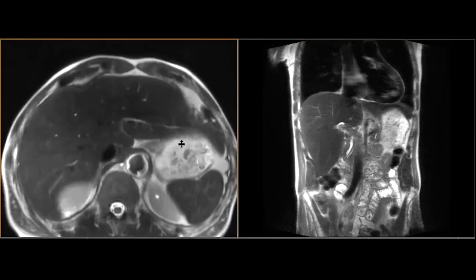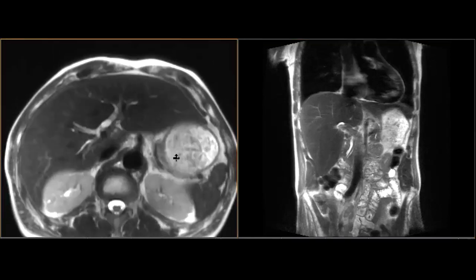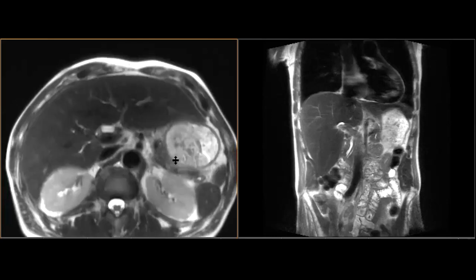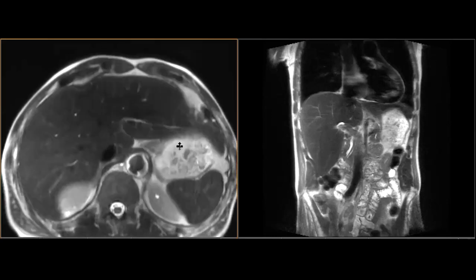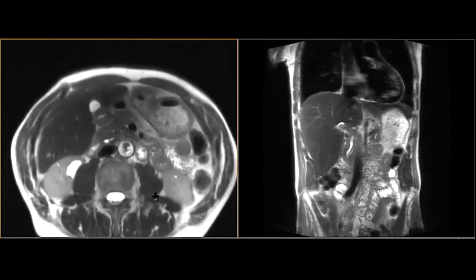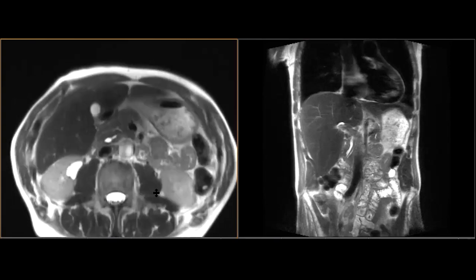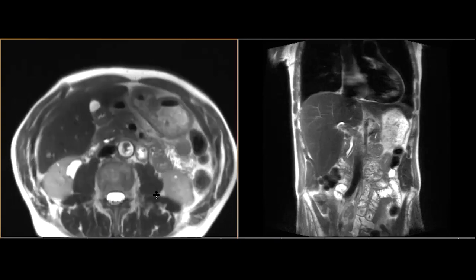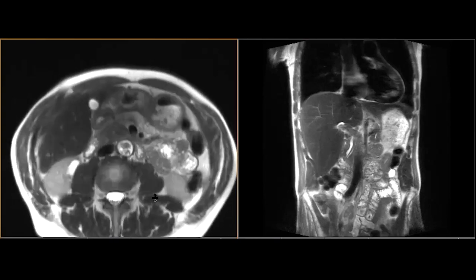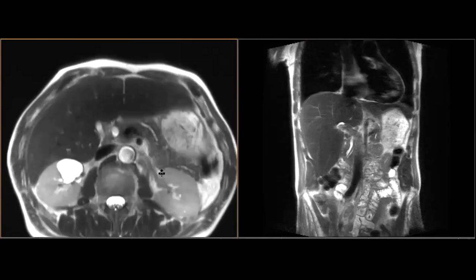In this case, the dilated ducts don't have the appearance of primary sclerosing cholangitis — they are dilated all the way to the ampulla. Given the history of AIDS in this patient, there is likely some element of papillary stenosis resulting in this ductal dilatation.